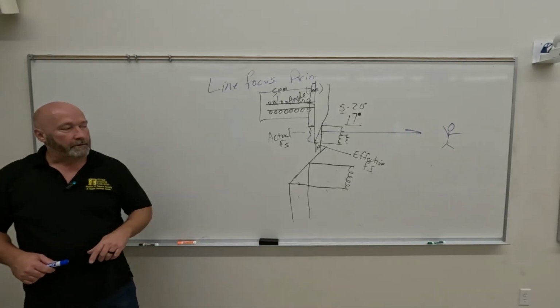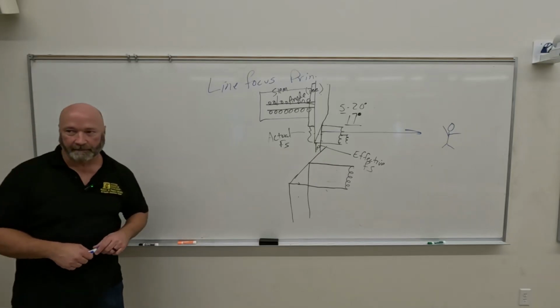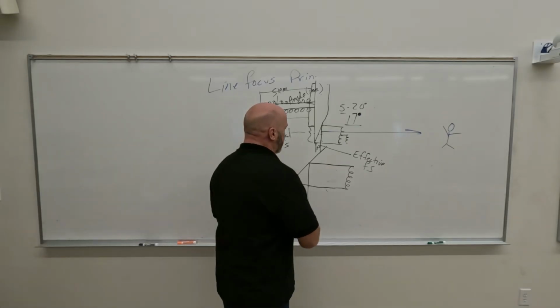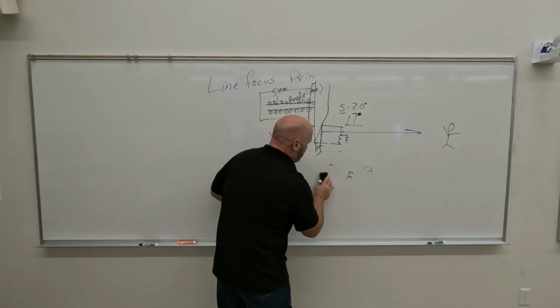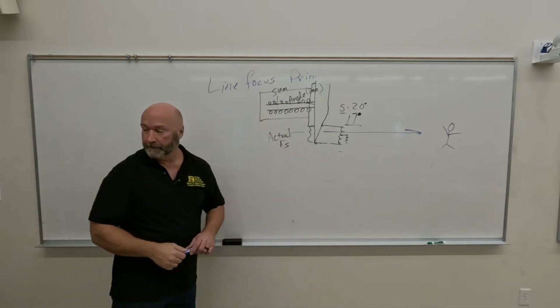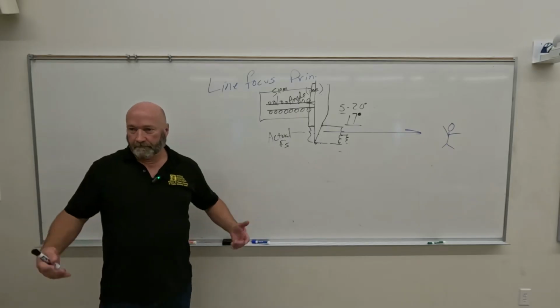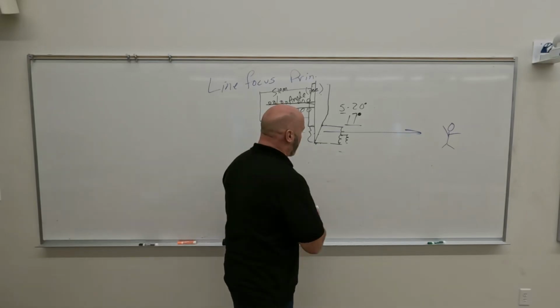The unfortunate consequence of this is shown on page 121, and Amy's probably talked about this already. If you look on page 121, what you find is that our anode is made of tungsten, and tungsten is a heavy metal. You know what you know about metal, right? How does it look on X-rays? Solid white. You can't see through it at all.